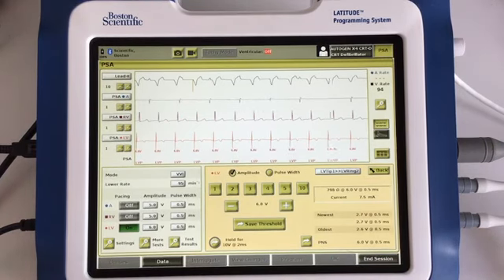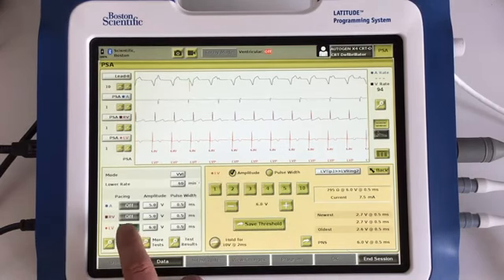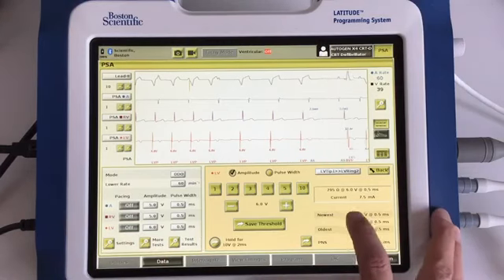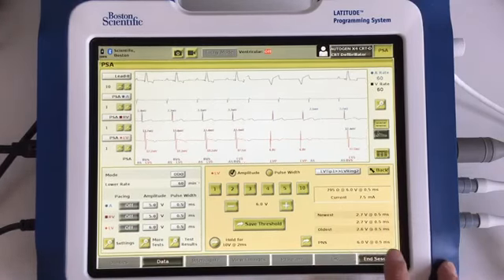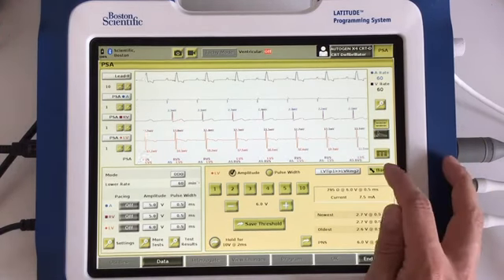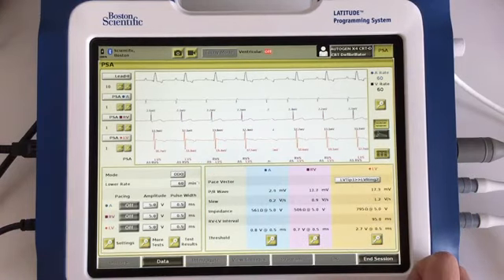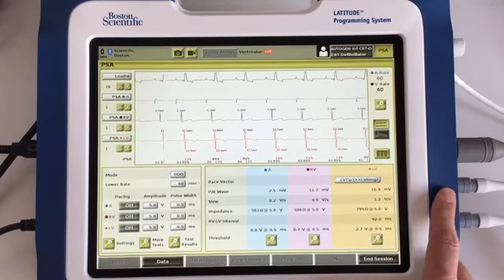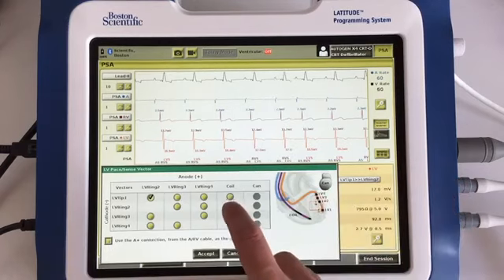So let's wean off and then stop our pacing. So using this vector, our impedance is okay, our threshold is a bit high and we've had twitching at relatively low output. So let's try some different options. As you can see, the RV to LV interval is displayed. At the moment we're using electrode 1 and it's around 90 milliseconds. So let's go through some of the others.